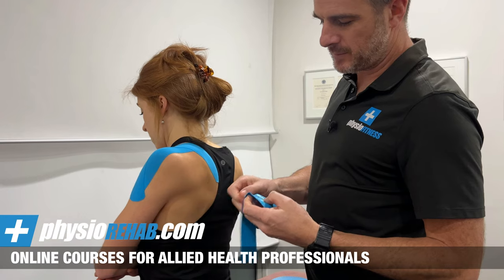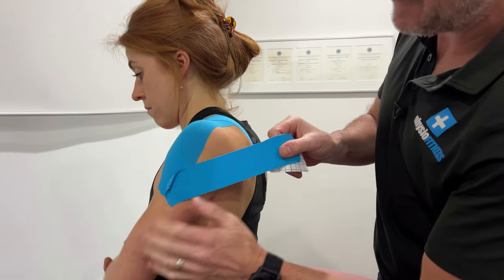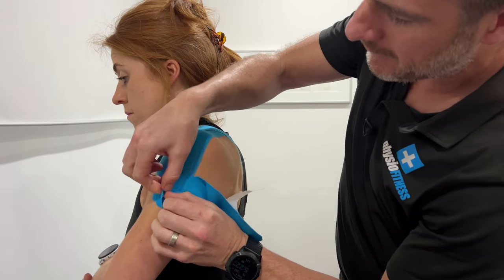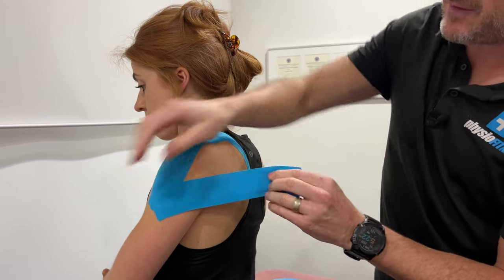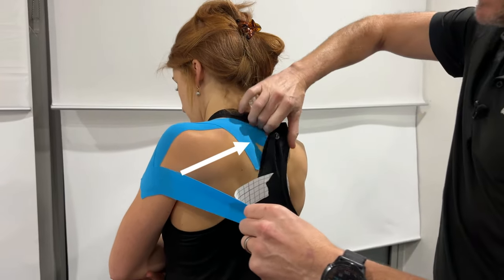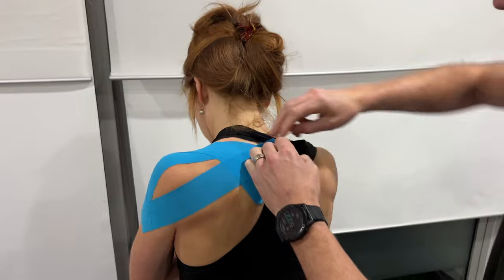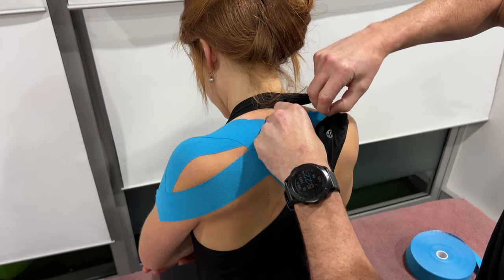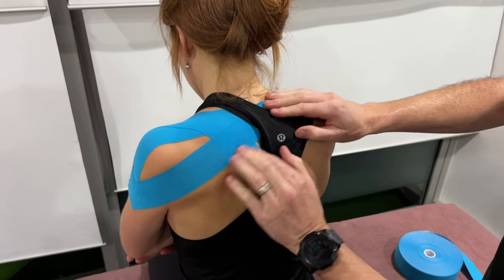The last strip, going from the back, is almost the opposite of the second one. Get that nice and flat — always make sure those edges are nice and flat. Zero at the anchor, then you're going to come across the rotator cuff here up to the top. You can probably afford to go even a little further over with this one, but I would never go any shorter than that.